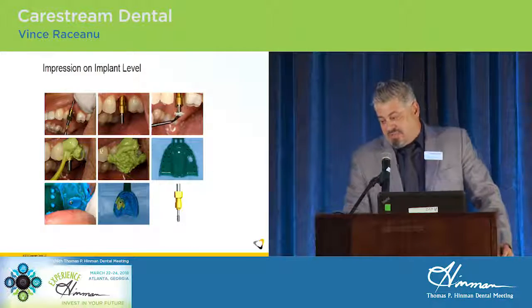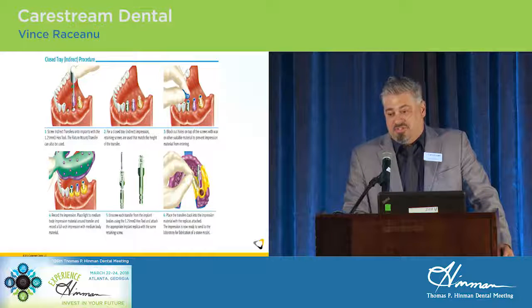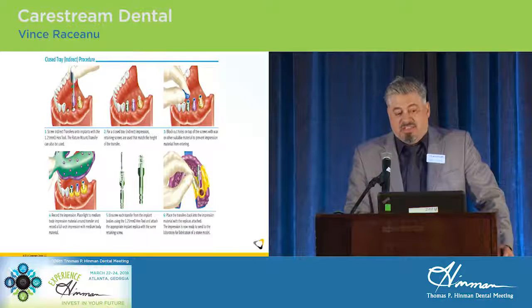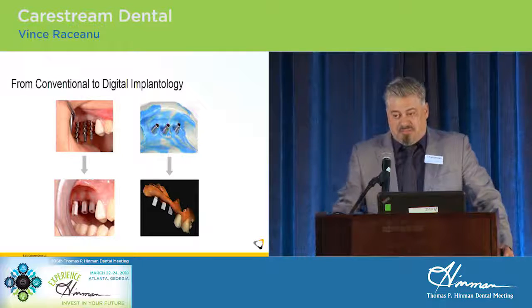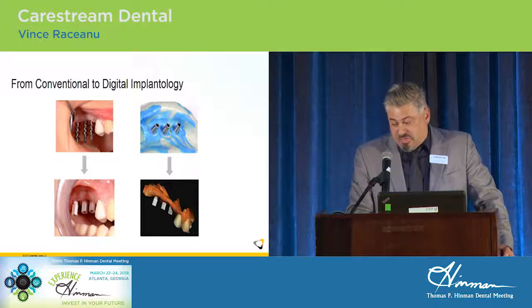We mentioned implants. Again, there's going to be a lot of skipping. Open tray or closed tray procedure where you're dealing with transfer copings and things of that nature is a thing of the past. You're able to scan something called a scan body, which represents the implant or the lab that it comes from. That's what you basically end up scanning to get a custom abutment made and a crown for the final restoration.